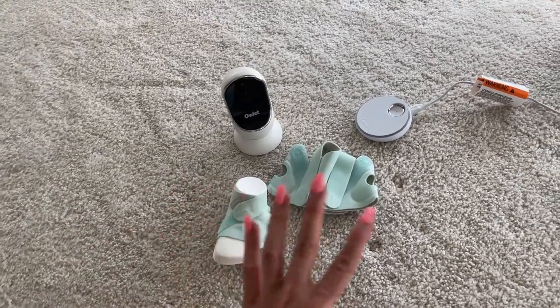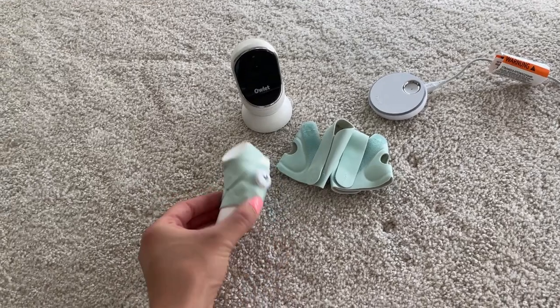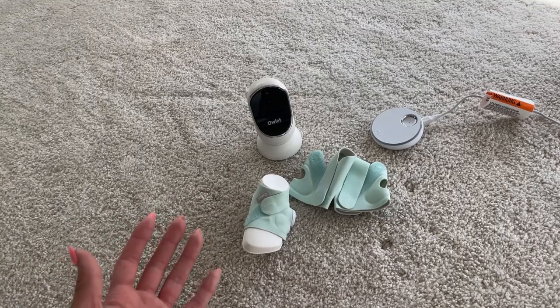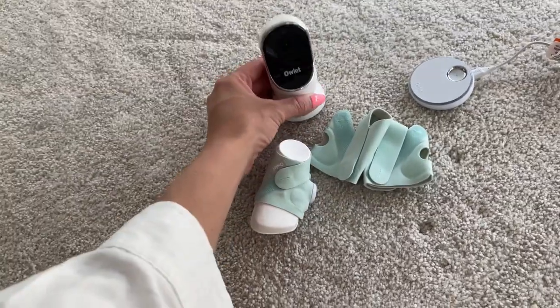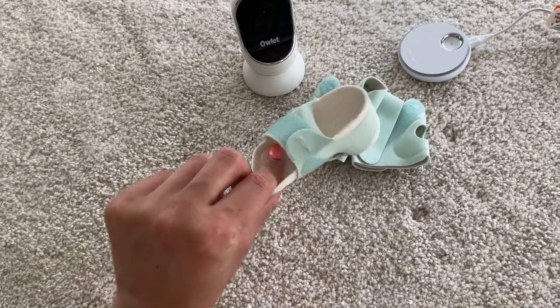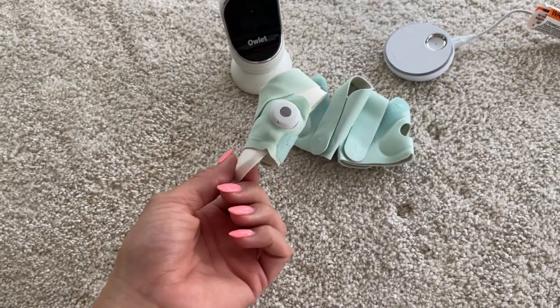You don't have to buy the kit — you can just choose to buy the dream sock if you want. But I would recommend getting the kit if you're thinking about getting a camera because it will be a lot cheaper.